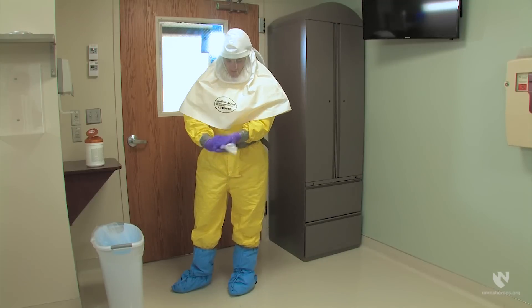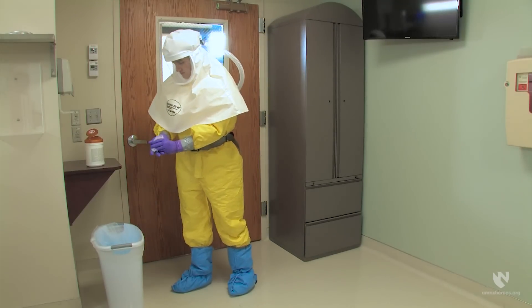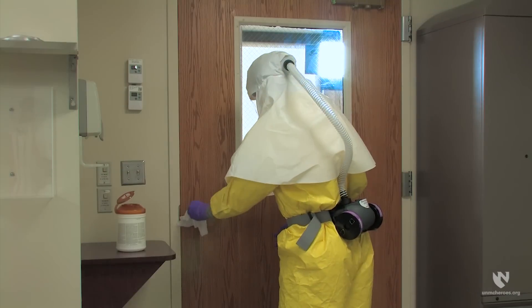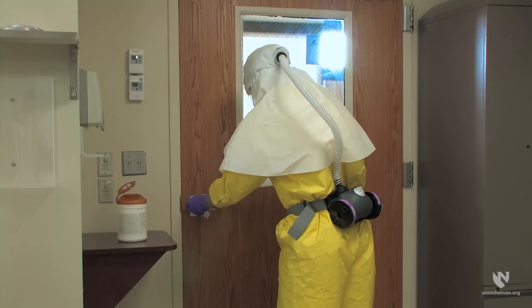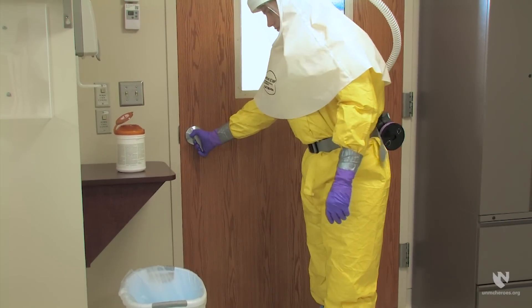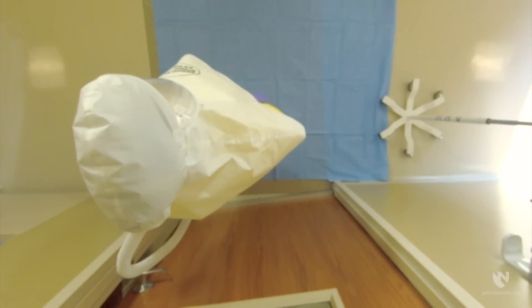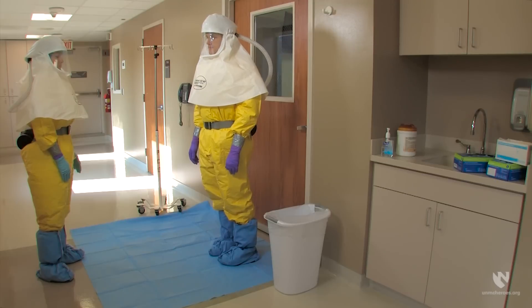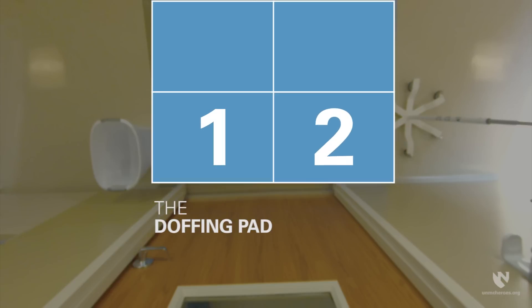Before opening the door of the patient room, bleach wipe the long cuff purple nitrile gloves and the handle of the door. Dispose of the bleach wipe in the trash before you exit the room. Open the door and step onto the first quarter of the doffing pad — the one furthest from the IV pole and closest to the door. Think of the doffing pad as four separate quarters that you will navigate as you doff your personal protective equipment.